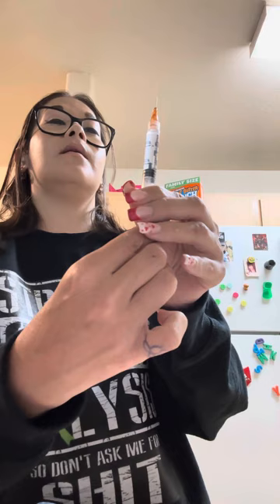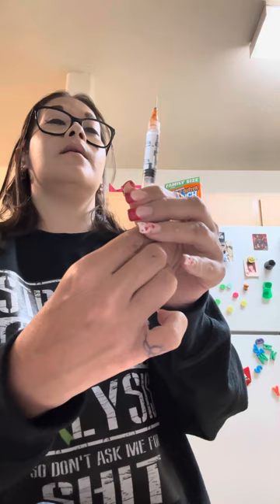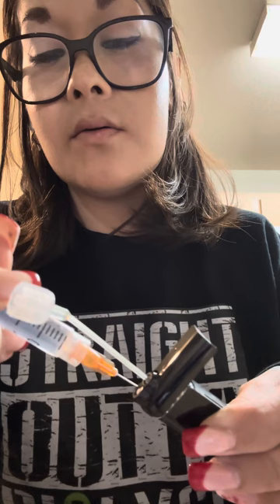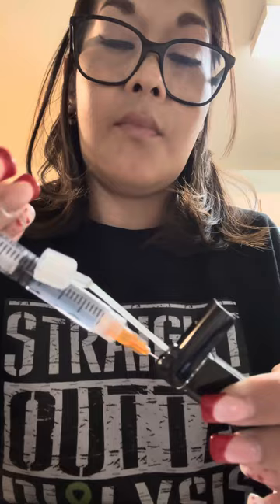I like to get the air bubbles out. Draw it up like this. When a little bit of insulin comes out the tip, all the air is out. Then I get my little cartridge and you're going to poke the needle where that little dot is right there.